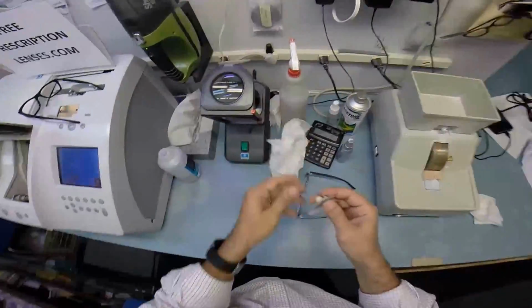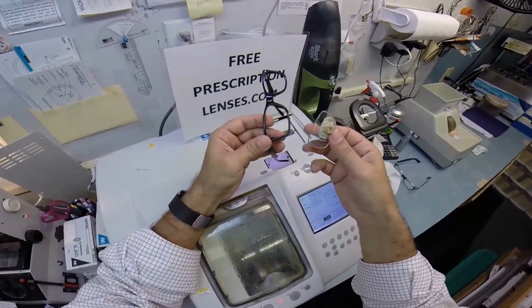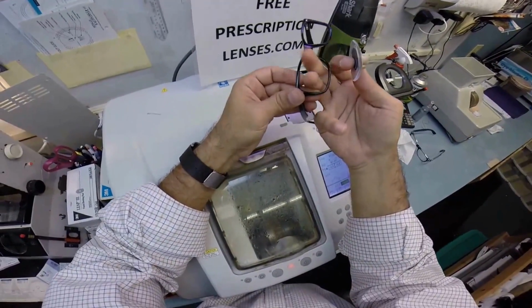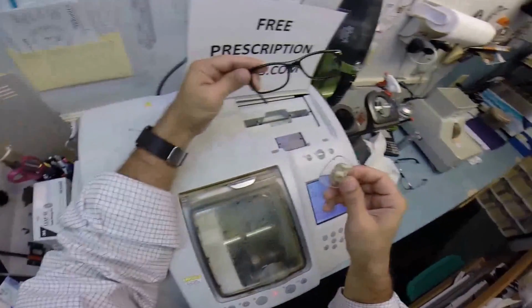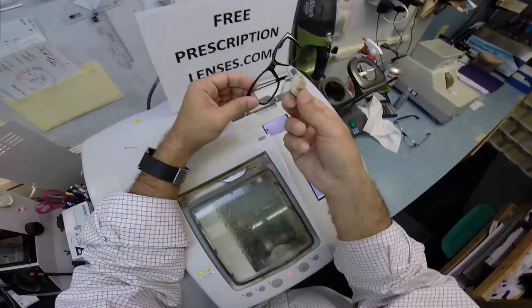Should you leave them in the car, I don't know how cold it gets there, but just make sure your frame is at room temperature. I'll show you how to do this, but I have the frame with the side that I'm working on closest to me. So don't worry, they're going to make this frame for several more years. But Kathy, if you ever buy another color of this frame, you're going to be able to pop your lenses in and out.